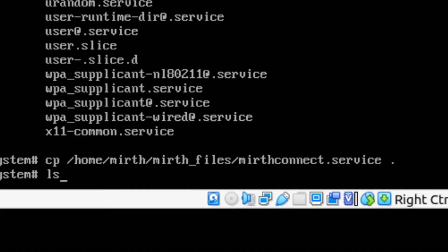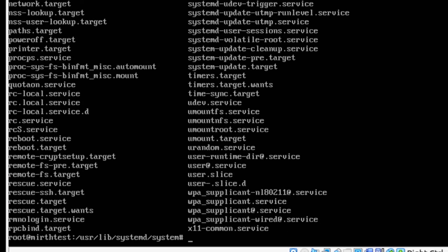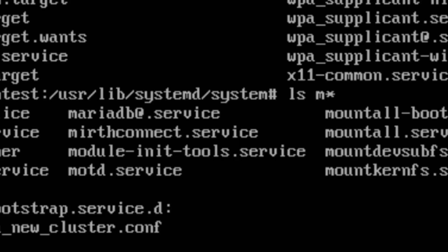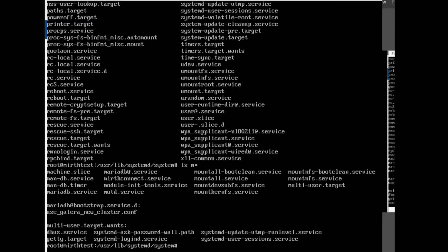Now if we do ls we should be able to see in here. I can't really see it too well. If I do ls m star we can see in here we have our MIRTH Connect dot service. So that's good. That means that the service file is in place and it's ready to be enabled.